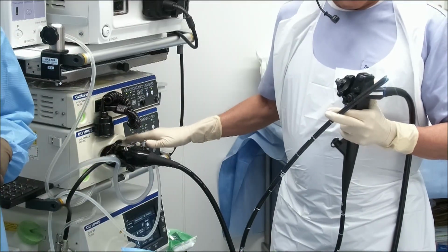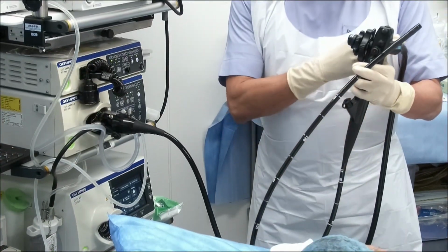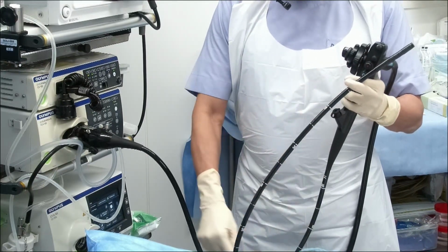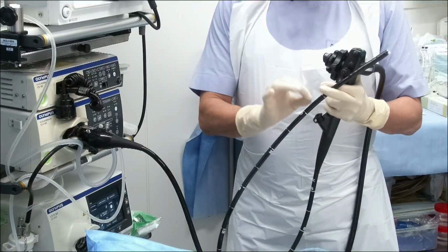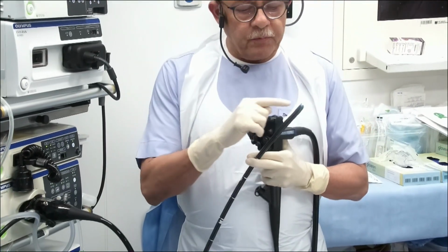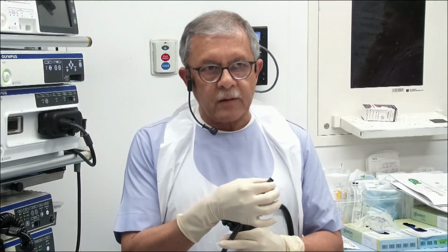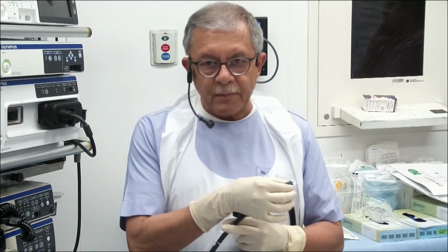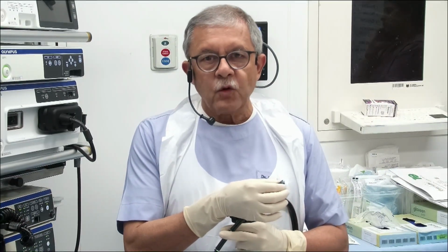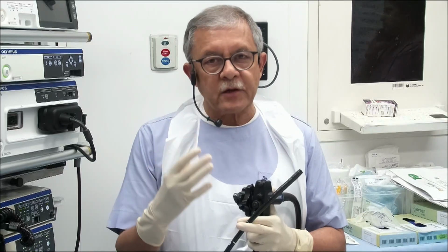From there light is supplied, which comes through various fiber optic cables through the connecting tube to the control body, and then comes out again by fiber optic cables or by electric cables to the tip of the endoscope. Now, the tip of the endoscope is extremely important because at the tip we have a very tiny camera. This camera has a high magnification capability, and by pressing certain buttons on the control body, we can also increase the magnification or the resolution of the image that you see.